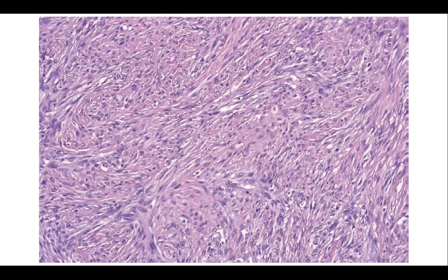You need to know the more common and more important entities, for example, atypical or sarcomatoid squamous cell carcinoma. Squamous cell carcinoma can sometimes be very spindle shaped. You should think of amelanotic melanoma, which also could be spindle shaped. And you should think of angiosarcoma, which sometimes can develop spindle shaped cells, or a leiomyosarcoma. Very good, Michal, leiomyosarcoma. These are the entities that you should think of mostly.